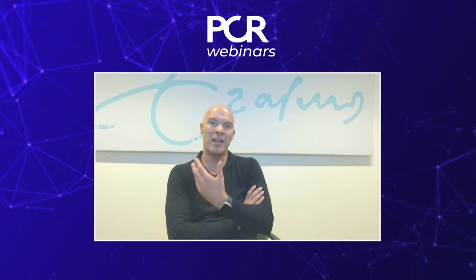That is, I think, the added value of ultrasound guidance. If you really know how to use ultrasound, then you see your Cook needle enter the vessel, and in principle you know that you've entered the vessel because you've seen it, and you see the pulsatile flow, and you have avoided the calcium. So I don't see the added value of micropunctures with ultrasound guidance, to be honest. And then when do I give heparin? I give heparin once I have obtained all my accesses. So I do the radial access and then the 2 femorals, and then I give the heparin.